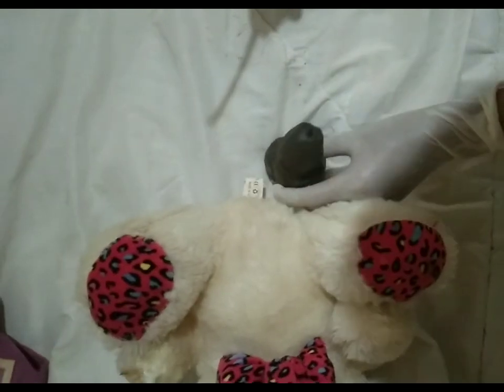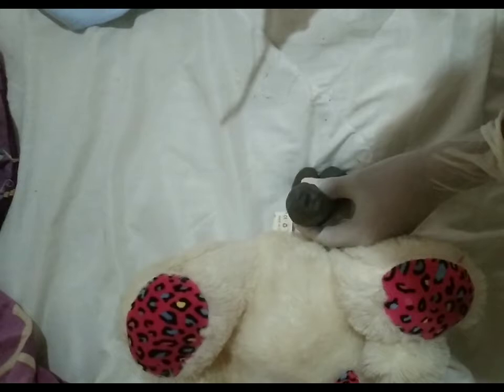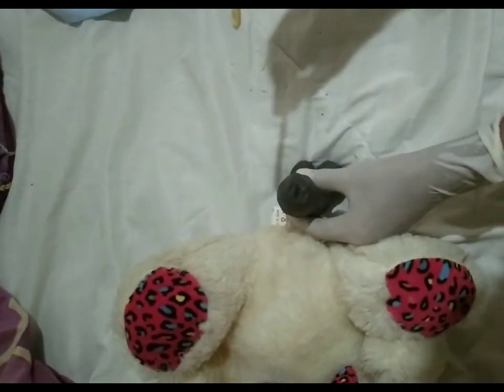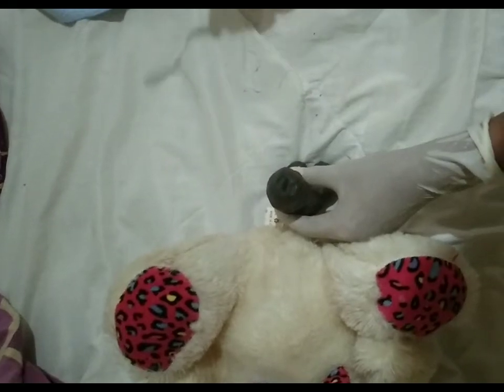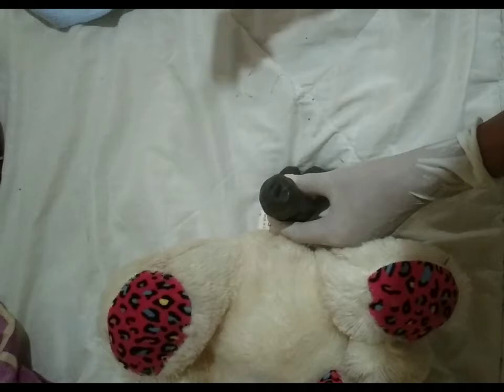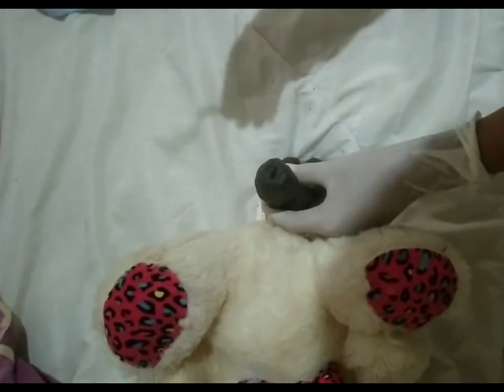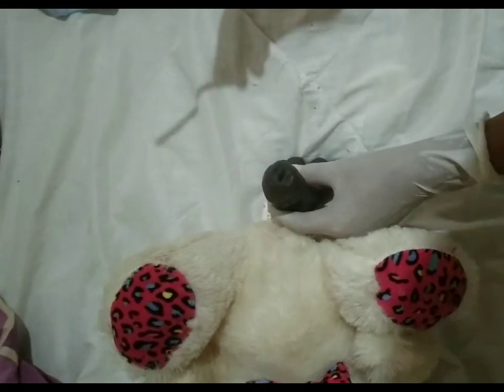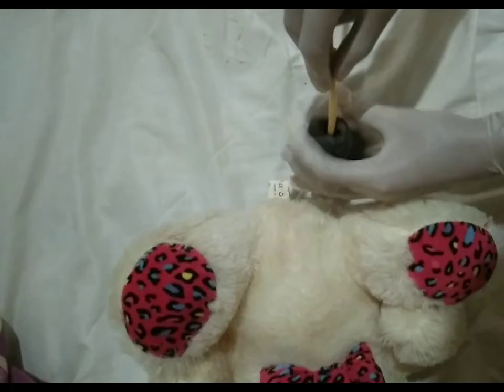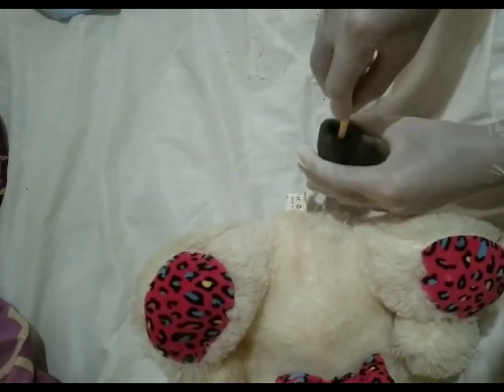For the insertion, hold the penis of the patient and gently raise it upward. And now we will ask the patient to inhale, exhale, and relax. Okay, sir, can you please inhale and exhale for me and just relax? We will be inserting the Foley catheter. So okay, inhale and exhale.